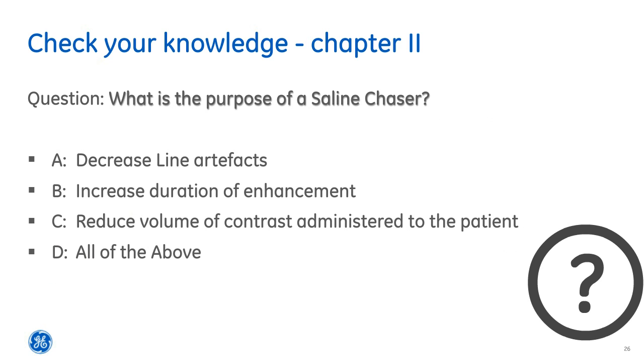So here we have our next question. What is the purpose of the saline chase? And it is in fact all of the above.